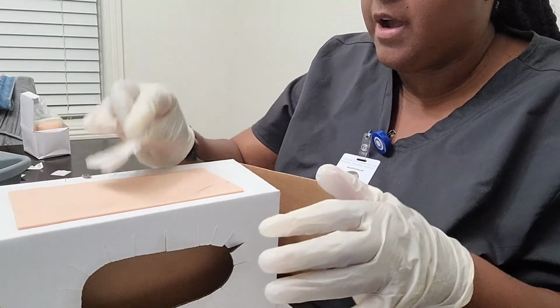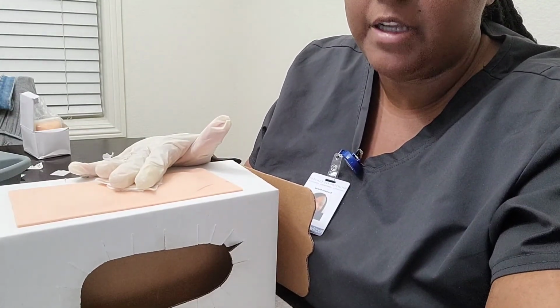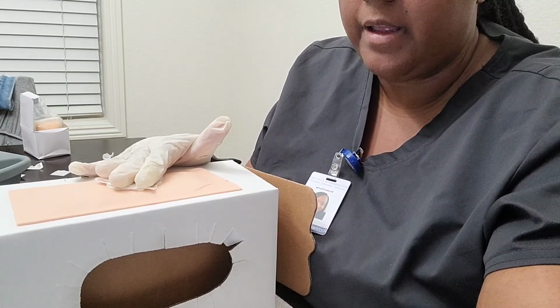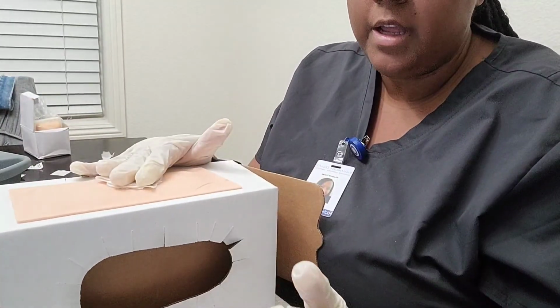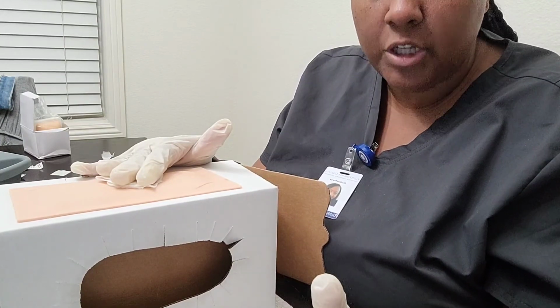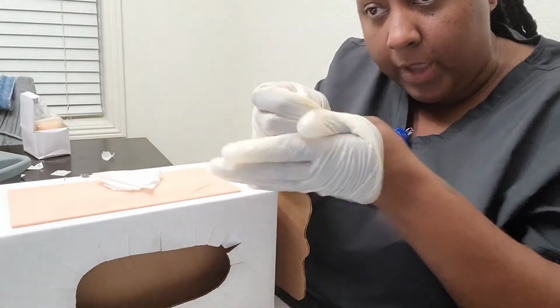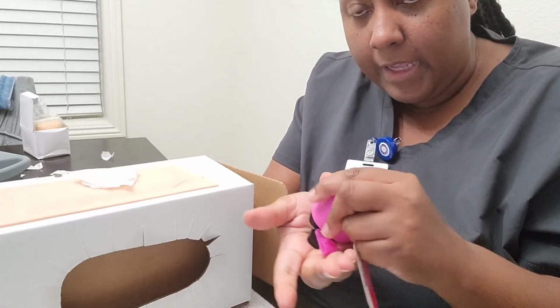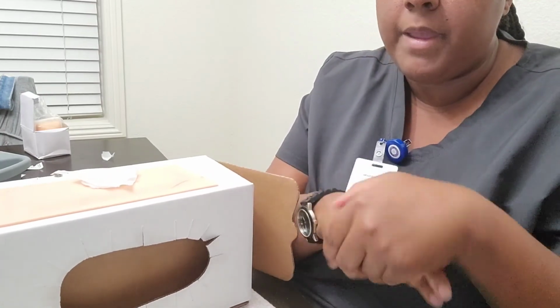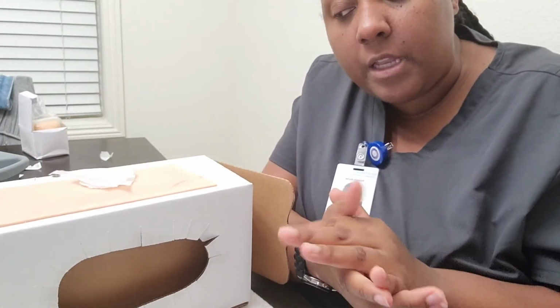And then also I will go ahead and place a gauze gently over the site. Do not massage it. But just apply gentle pressure to the site, but I'm not massaging. And I discarded the needle and syringe into a sharp or puncture-proof container. Okay, and so now I'm going to go ahead and remove my gloves and perform hand hygiene, and then I will go ahead and document the procedure and leave the patient in a comfortable position, and document the procedure.